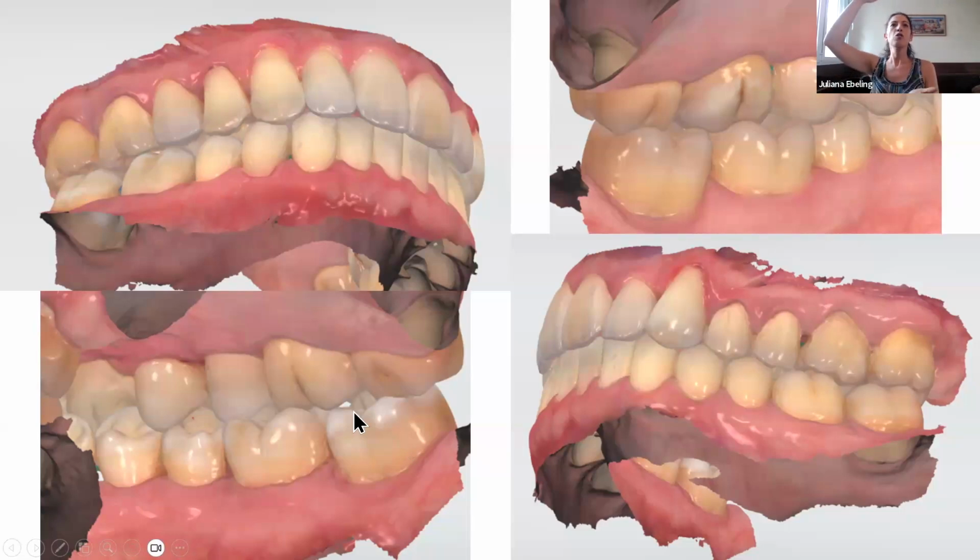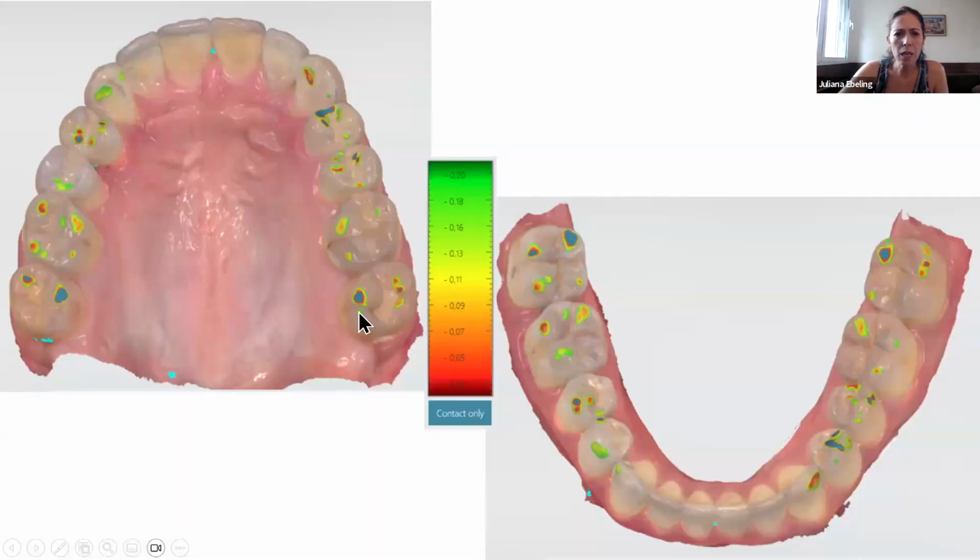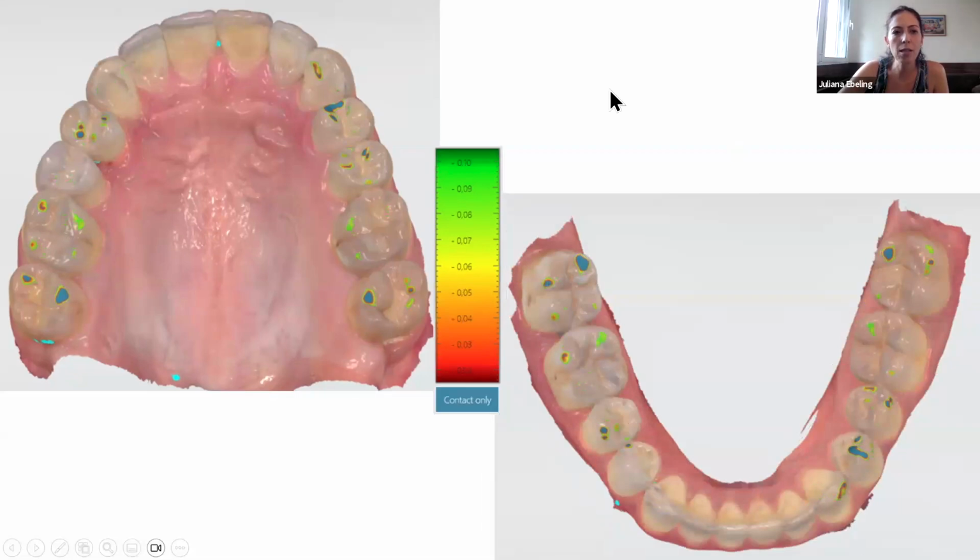I have to record that stable contact distribution when I use OccluSense, with the same graphic happening during the recording. And here it's with 200 micrometers distribution of the contacts. We had some challenge in some undesired cusps, but we will see that this distribution is very stable.